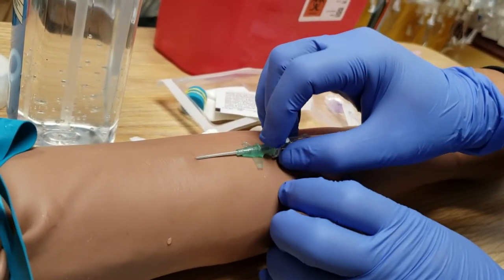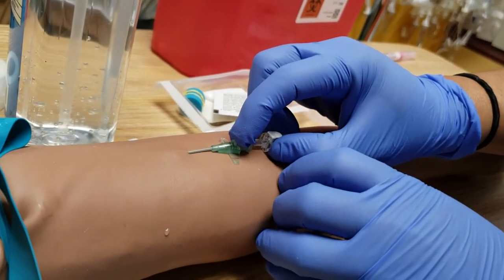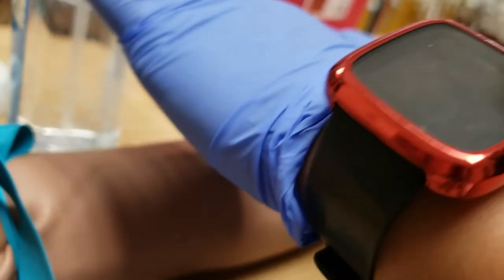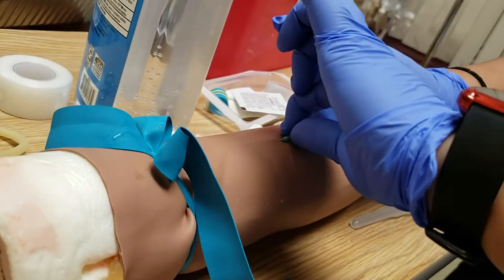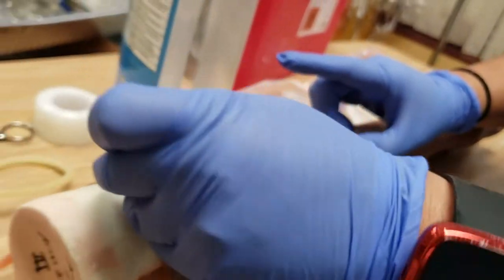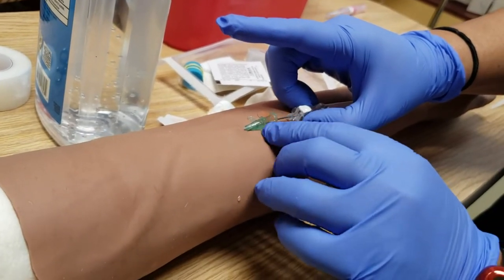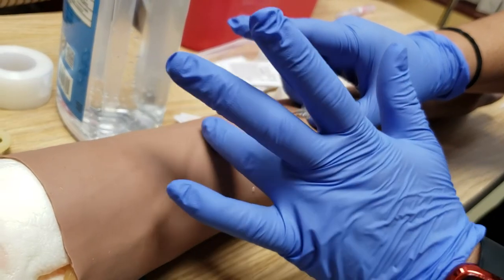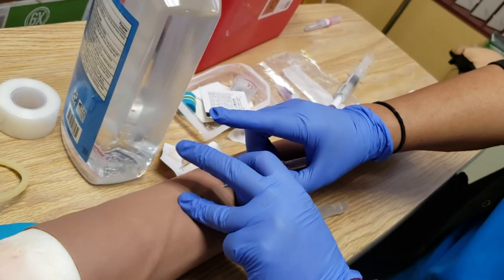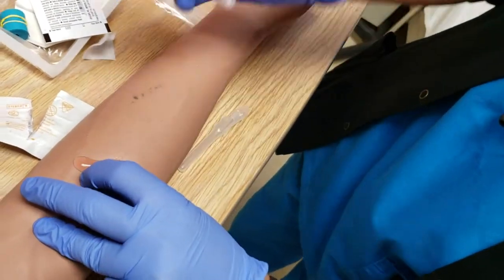See this little flange here — I'm going to use that to push. I'm keeping this stable while I'm pushing with my finger. If that's hard for you, you can also use this technique: take this and push forward. I still haven't moved this. Now I'm going to take my tourniquet off and make sure that's loose. Find the tip of the catheter, use this finger, and push it on there. These two fingers I'm going to use to hold that in place, and when that's stable, now I can push the button.